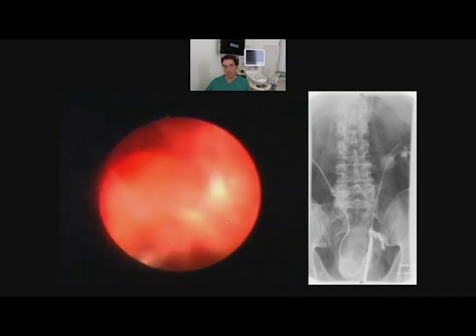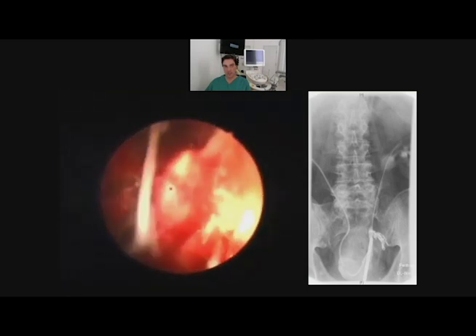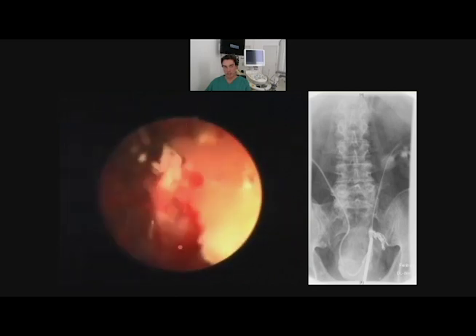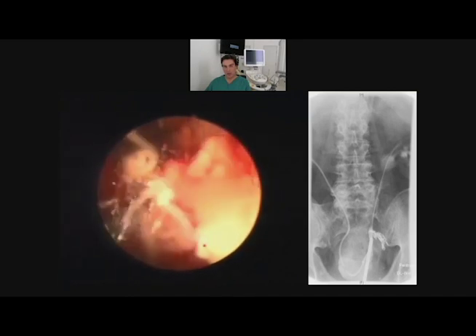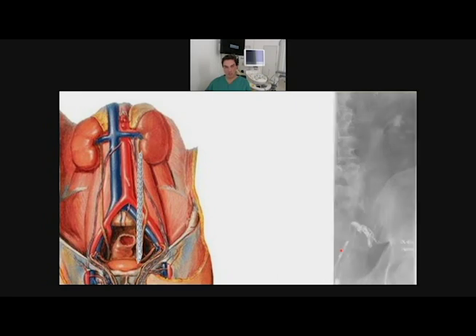What you see here is the distal part of the ureter. And now you see the brown part. This is the part where the total necrosis of the ureter is. You see here some infection around. And what we do now is put a new stent on it and the fluid is coming. The ureter is destroyed from here to here. And what we do is only bridge, and all is okay. And we don't need any treatment because it's not a good idea to treat these patients. You can check it then and all is okay.